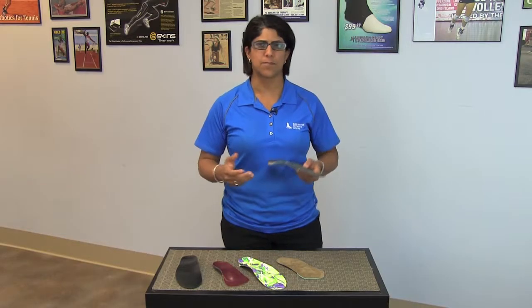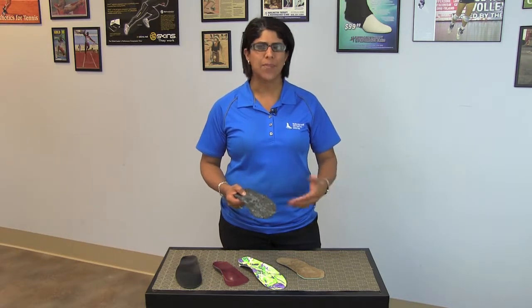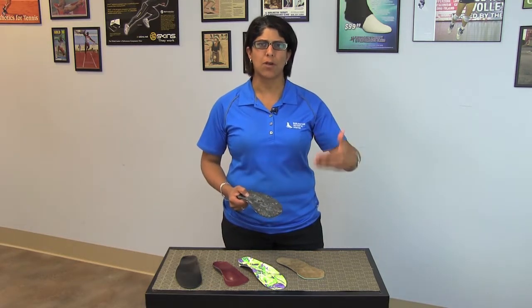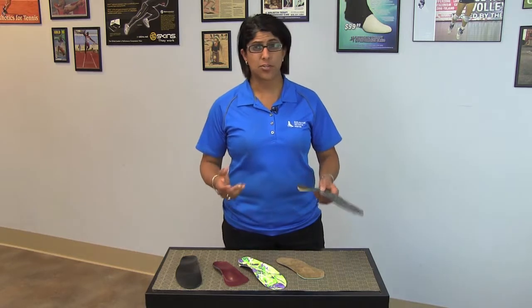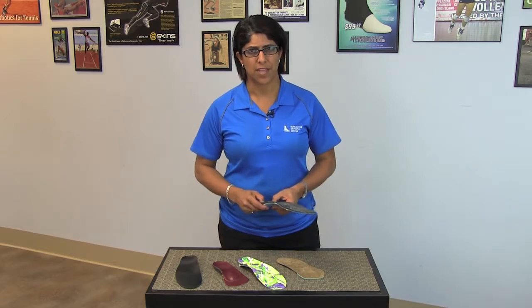Different people have different break-in times. We usually tell you to wear it for an hour the first time and then gradually break in your wear by an hour more every day. After two weeks, you should have absolutely no problem wearing your orthotics every single day.